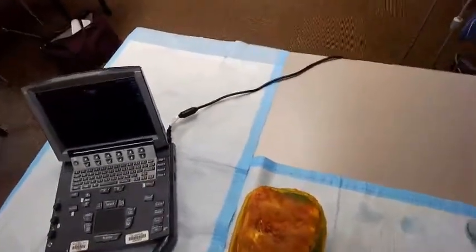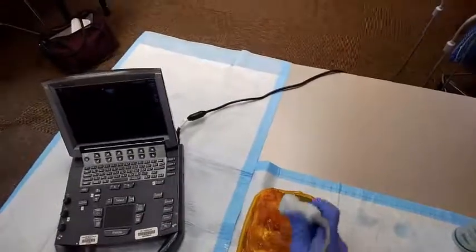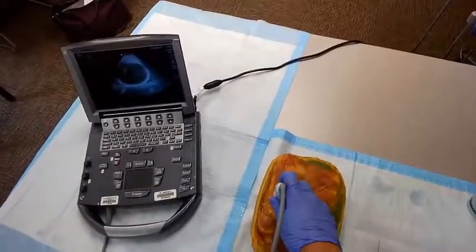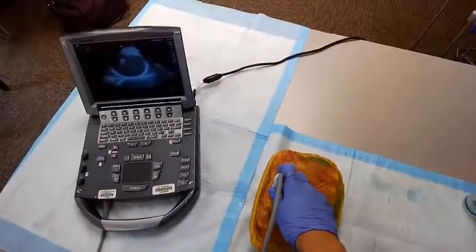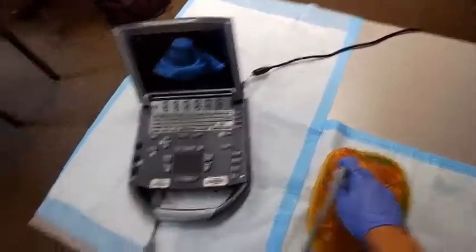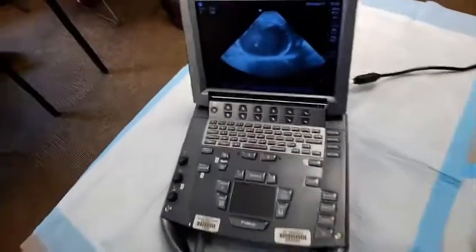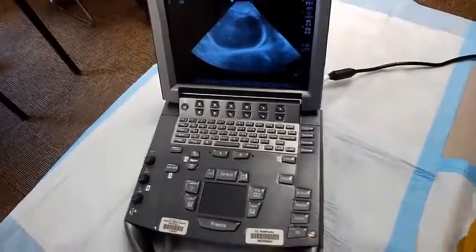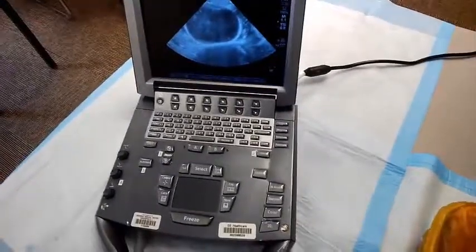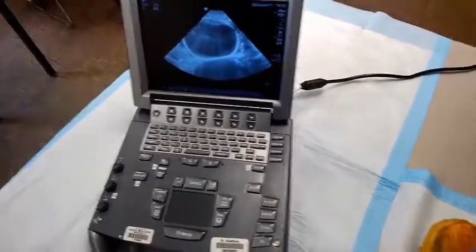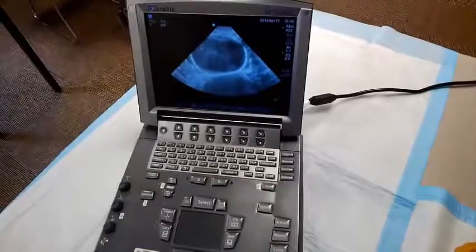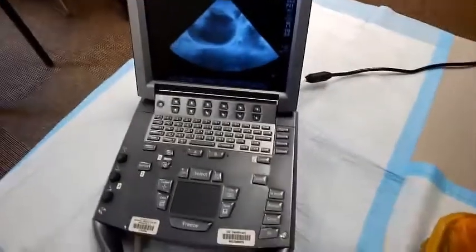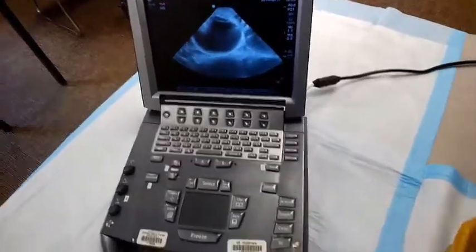Doing a parasternal long view, you'd be placing the probe right in that parasternal space. With our model, you can see this circular structure, which is the heart, with fluid on either side of it.